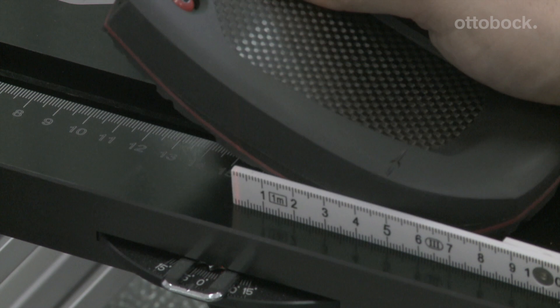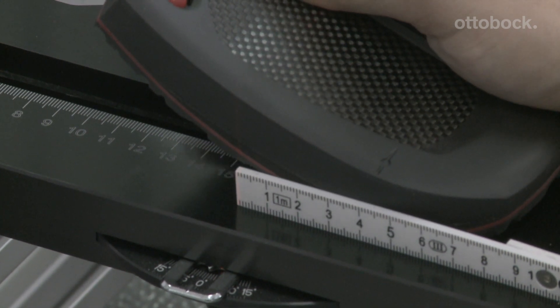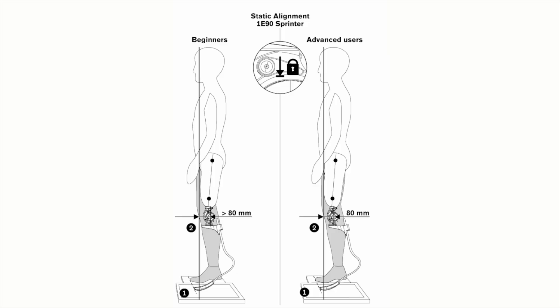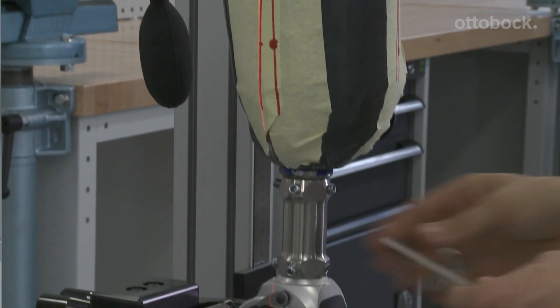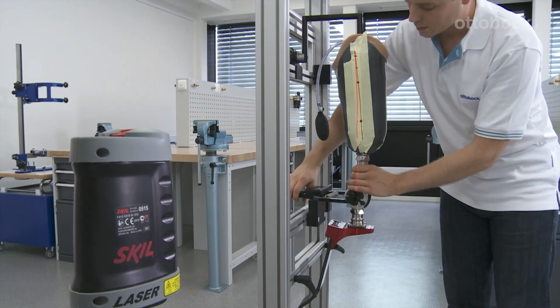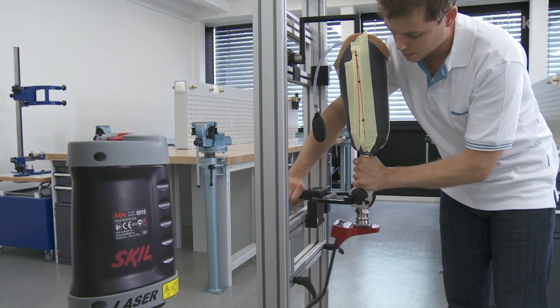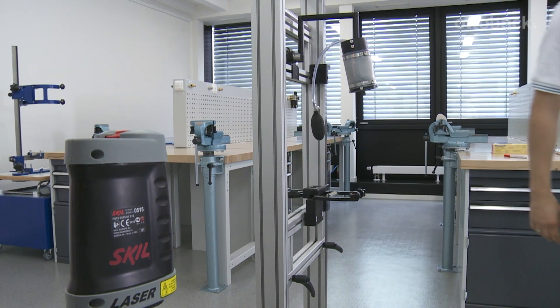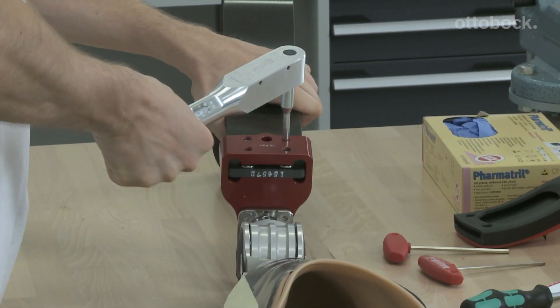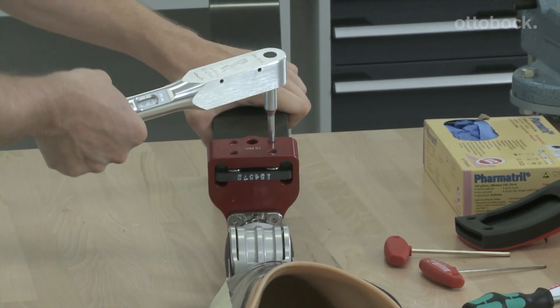The foot reference point is marked on the sole. It lies exactly on the alignment reference line for advanced runners and is shifted by 40 mm for beginners. The hip rotation point lies exactly on the alignment reference line. The flexion of the socket corresponds to the measured hip flexion angle plus 4 to 6 degrees extra flexion. All connections must be tightened with the corresponding torque to prevent accidents and avoid damage to the material.